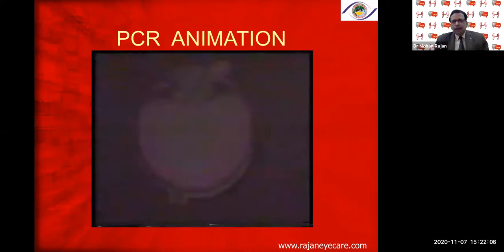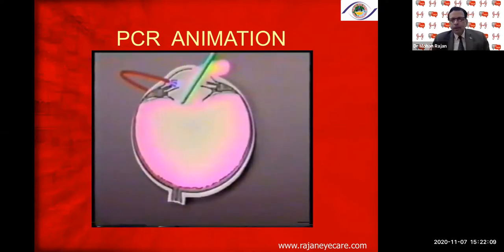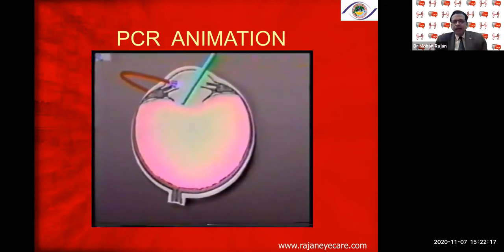But when you have a PC tear, you separate the irrigation from the aspiration. That is called bimanual, or you have an anterior chamber maintainer. Then we can remove the vitreous which is present there. The anterior chamber fluid tamponades the break and prevents the break from enlarging, and also makes sure that the vitreous is not hydrated. Whatever vitreous is there in the anterior chamber and the pupillary area, we can try and remove it by means of the vitrectomy.